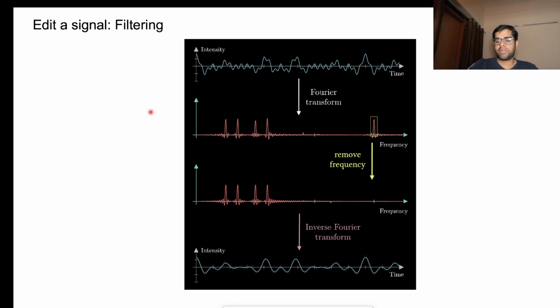Okay, so this is just an intuitive view of how to see the time and frequency representation of a signal. This is just a picture view, but if you take a real EEG signal, it's not this simple. The spectrum also looks very complex, and in a bit I'll show that too.